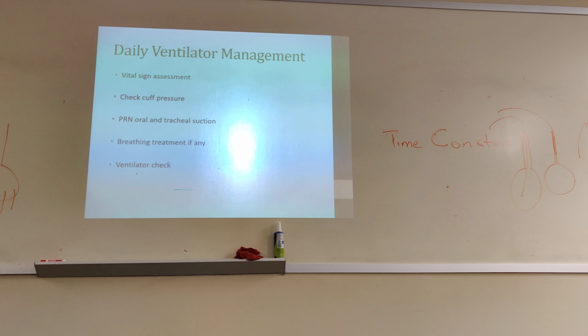Daily ventilator management: you do a vent check. It depends on the hospital. Some hospitals do it every 2 hours, some every 4 hours, so you do whatever your hospital does. Basically, you walk in and say, hey, Mr. Smith, how are you? Are you doing okay today? I'm going to check out your vent to make sure you're doing okay.